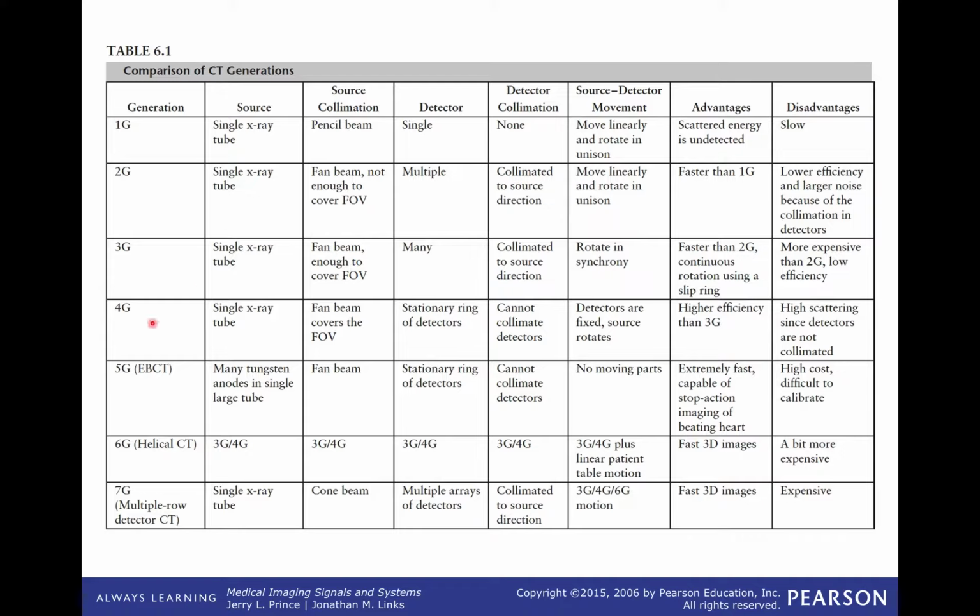For you guys, you're born somewhere in here, so it doesn't matter, right? What happened back here, it's historical artifacts, but it's nice to know the steps. The other thing that's nice to know is the first CT scans took half an hour to make. And so you had to believe in the technology. You know what I mean?